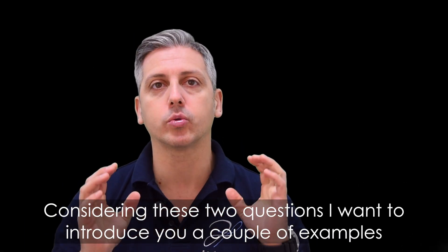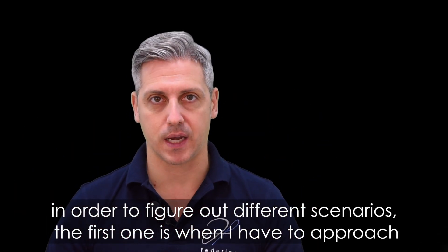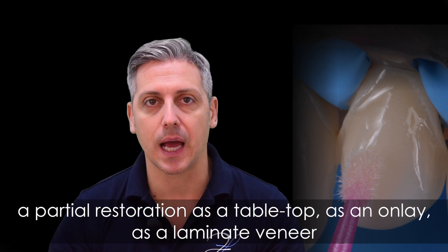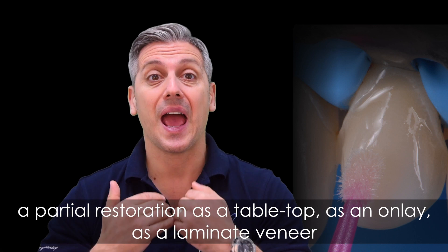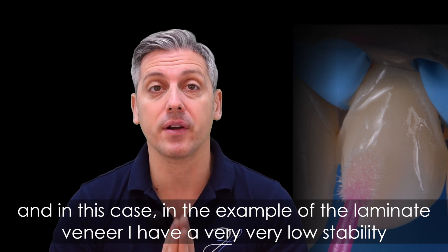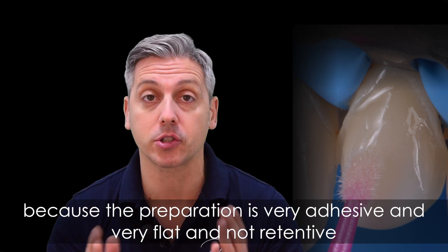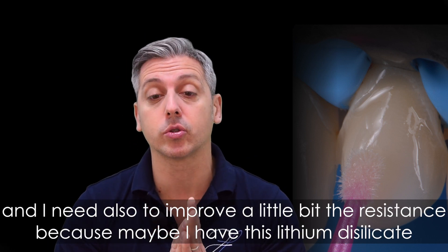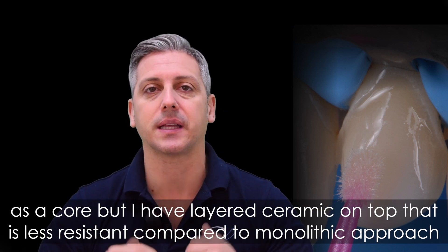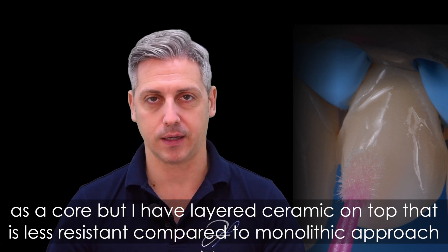Considering these two questions, I want to introduce a couple of examples to illustrate different scenarios. The first one is when I have to approach a partial restoration — a tabletop, an onlay, or a laminate veneer. In the case of a laminate veneer, I have very low stability because the preparation is very flat and not retentive, and I may also need to improve strength because the bilayered ceramic on top is less resistant compared to a monolithic approach.